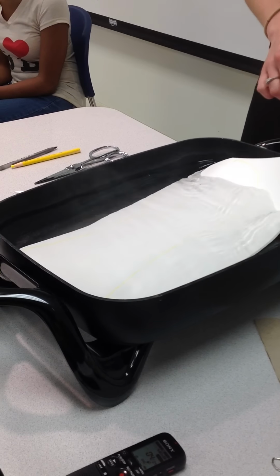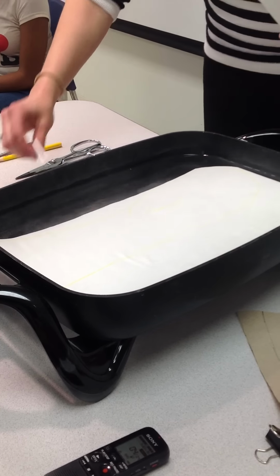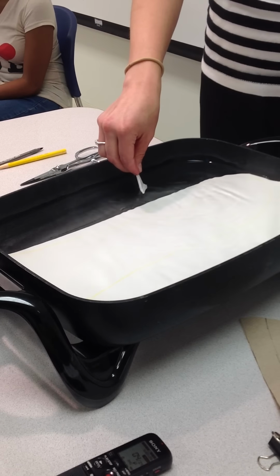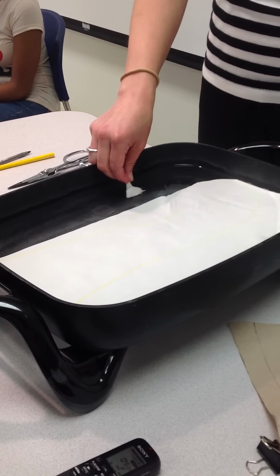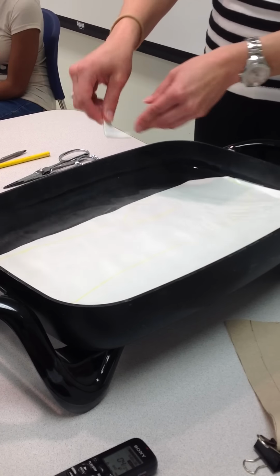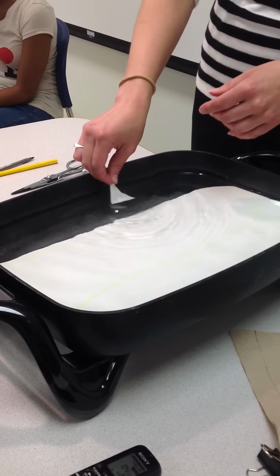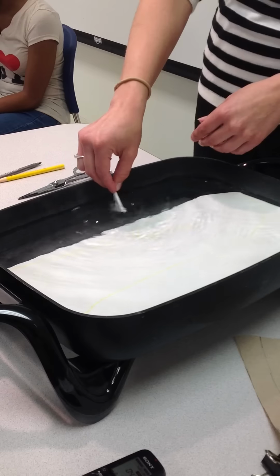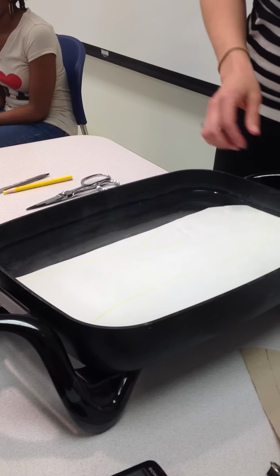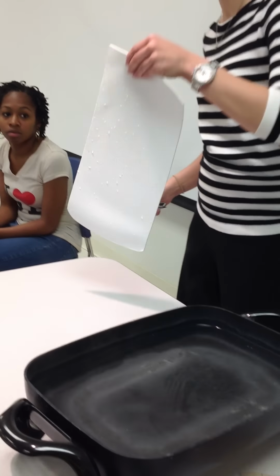How do you know when it's hot enough? It's really soft. You can cut off a little piece of it if you want to test before. I'd say a good 2 minutes, maybe not even that much. It's probably good right now. That's pretty soft. But see how it's just different? So I'm going to take it out and cut it, and depending on how long it takes me to cut, I might have to put it back in.